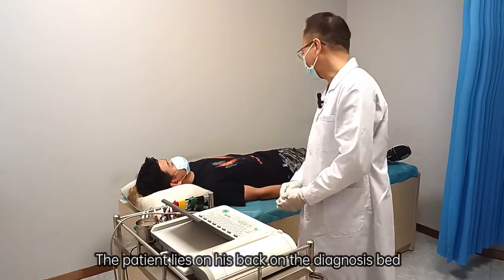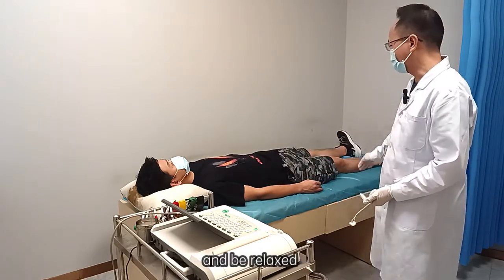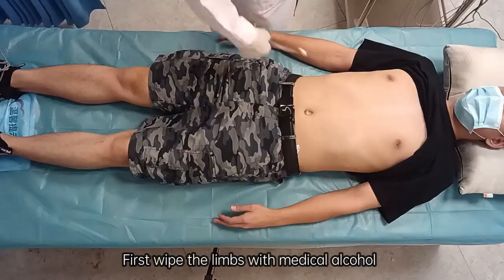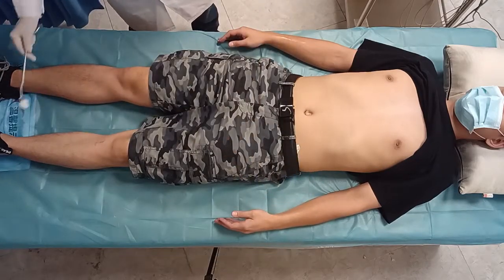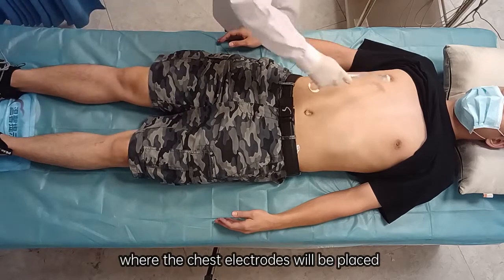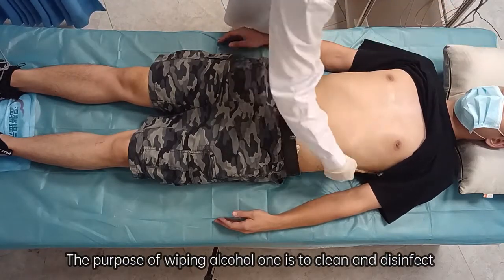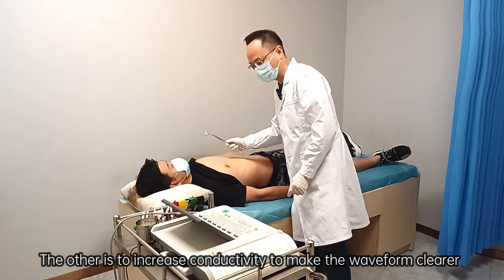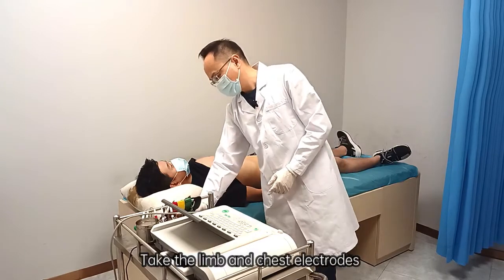The patient lies on his back on the diagnosis bed and should be relaxed first. Wipe the limbs with medical alcohol, wiping the inner side of the limbs and chest where the electrodes will be placed. The purpose of wiping with alcohol is to clean and disinfect, and also to increase conductivity to make the waveform clearer.